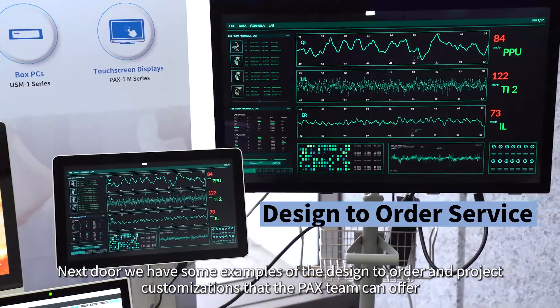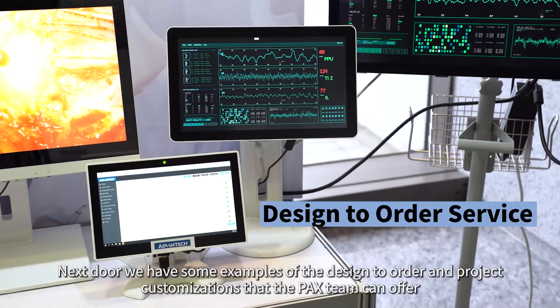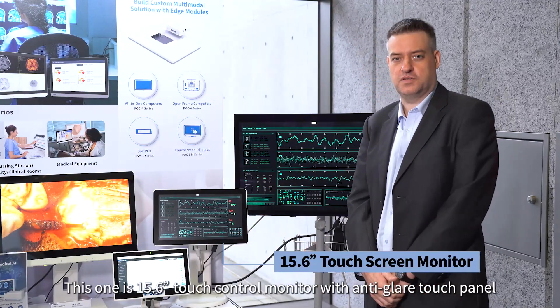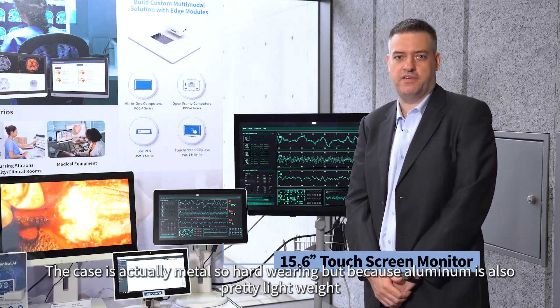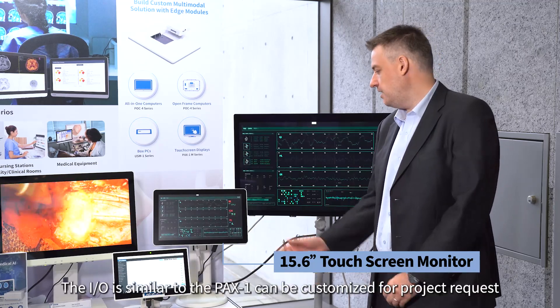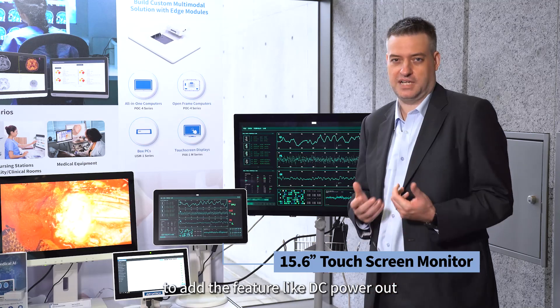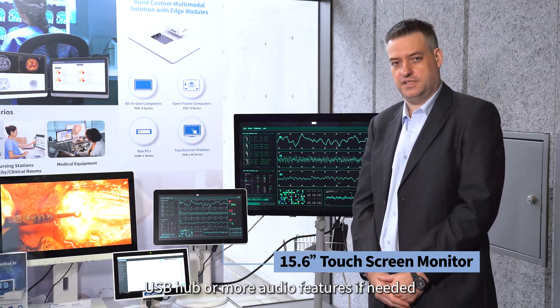Next door we also have some examples of the design-to-order and project customisation that the PAX team can offer. This one is a 15.6 inch touch control monitor with anti-glare touch panel. The case is actually metal so it's hard wearing, but because it's aluminium it's also pretty lightweight. The IO is similar to PAX1 but can be customised for project requests to add features like DC power out, USB hub, or more audio features if needed.